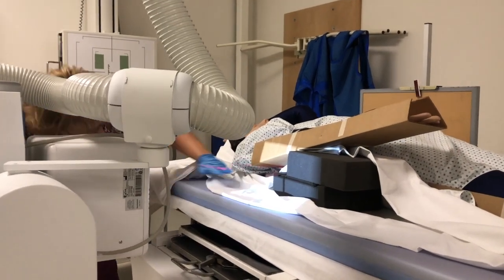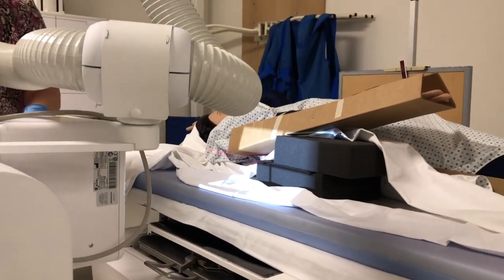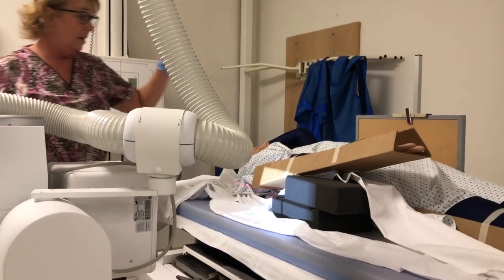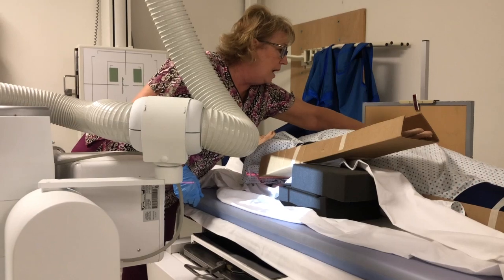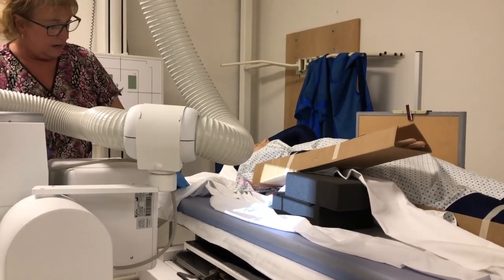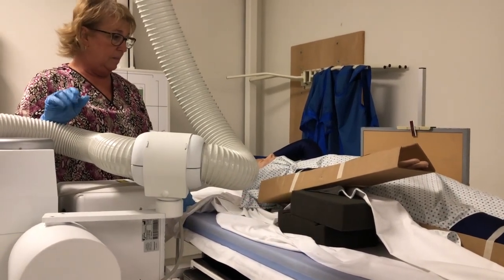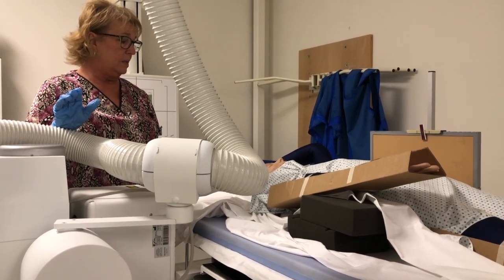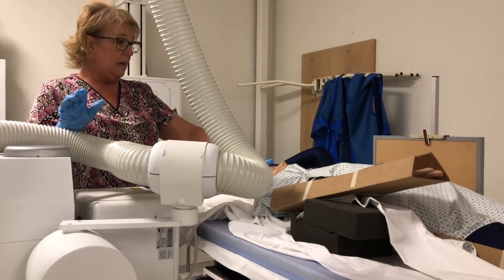I'm going to gauge where my mid-coronal plane is. Collimate. My left marker's on there. Maybe a little bit higher this time. And again, try to catch the patient in between respirations. So this is how you would do cross-table spine imaging if you had an injured extremity.